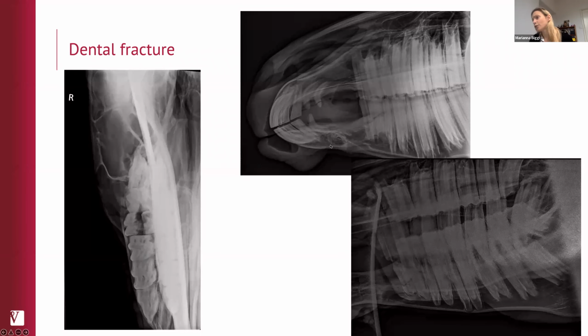This is an odd fracture that I have only seen once, and it's a transverse fracture. This was a traumatic fracture which occurred after this horse was attacked by a dog which was pulling on the bit, and traumatized this tooth.